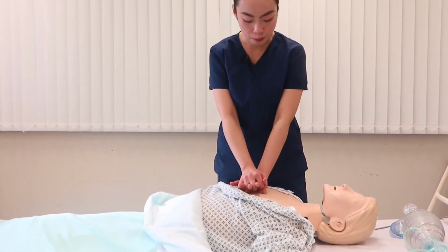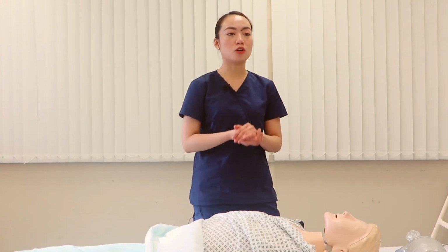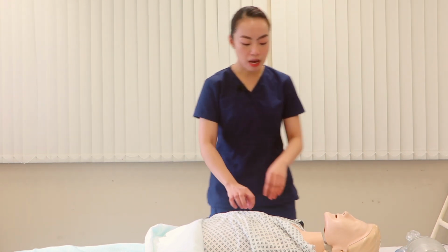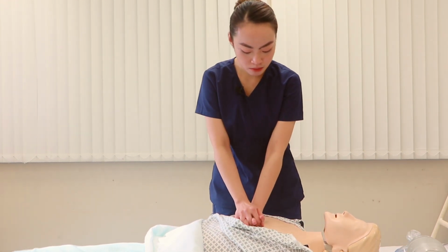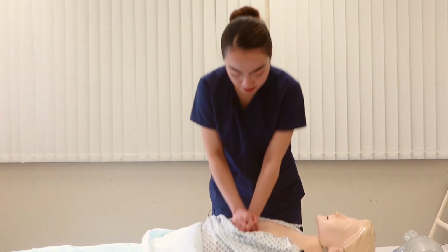I'm now going to start my compressions. Call 2222, alert the cardiac arrest team, and bring in the crash trolley attached to an automated external defibrillator with a bag valve mask attached to 10 to 15 liters of oxygen. I'm now going to start my compressions. 1 and 2 and 3 and 4 and 5 and 6 and 7 and 8 and 9 and 10.